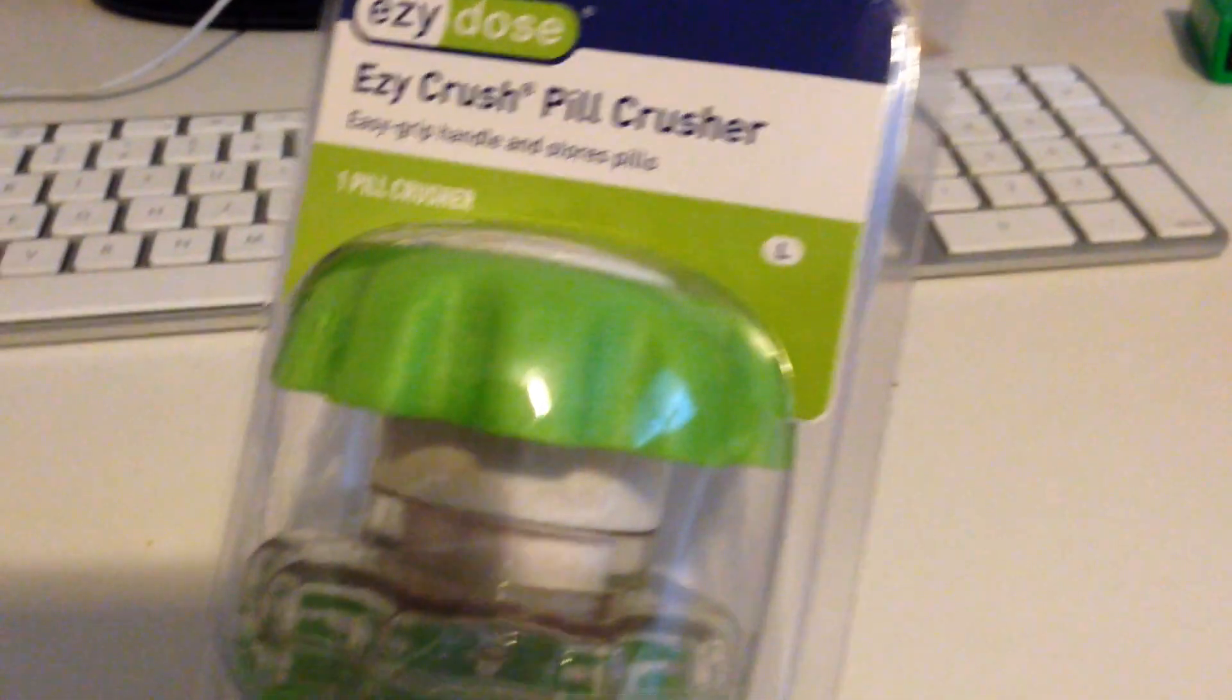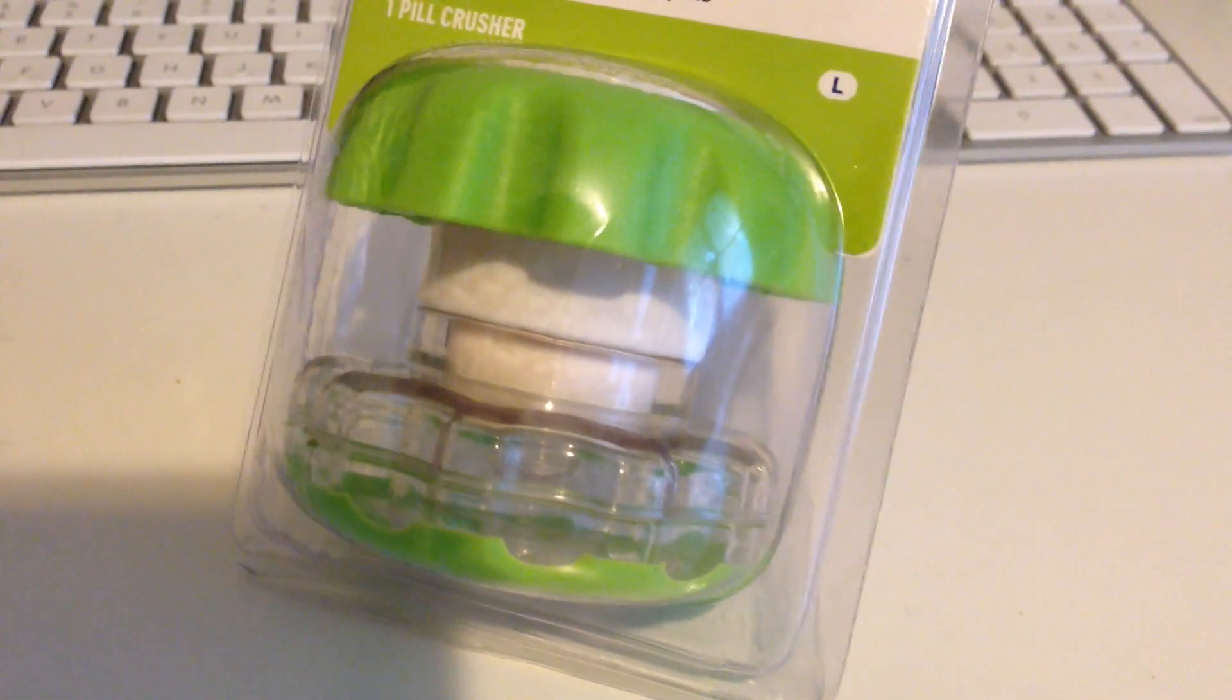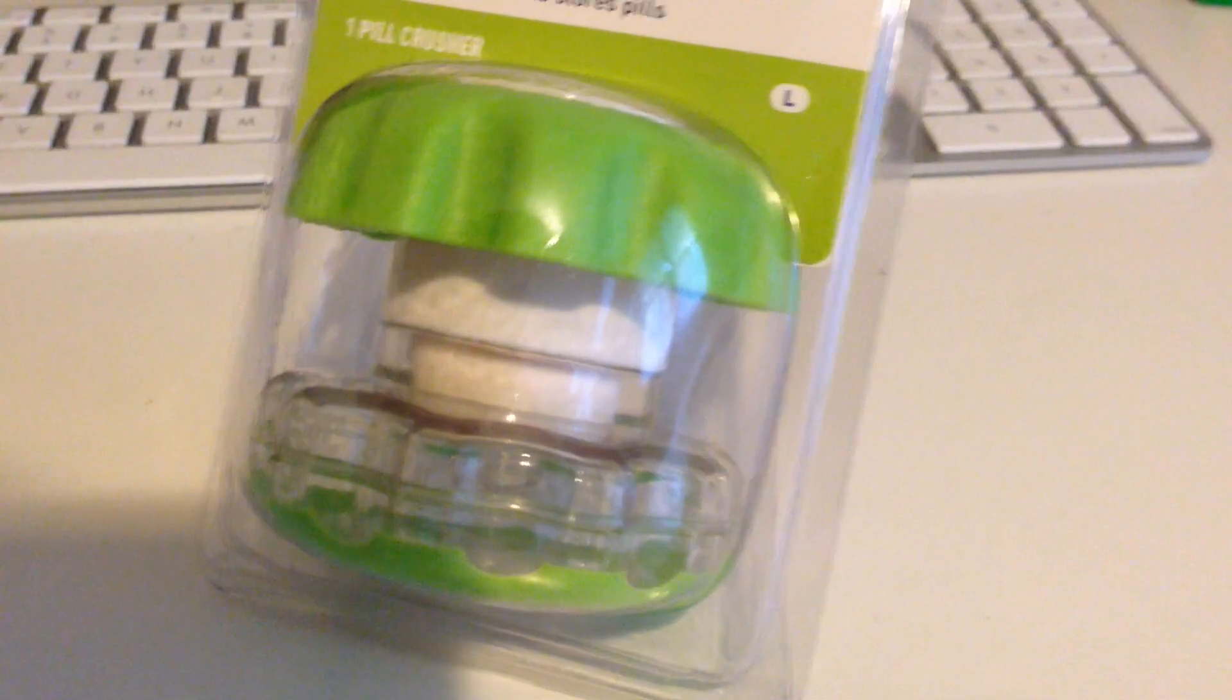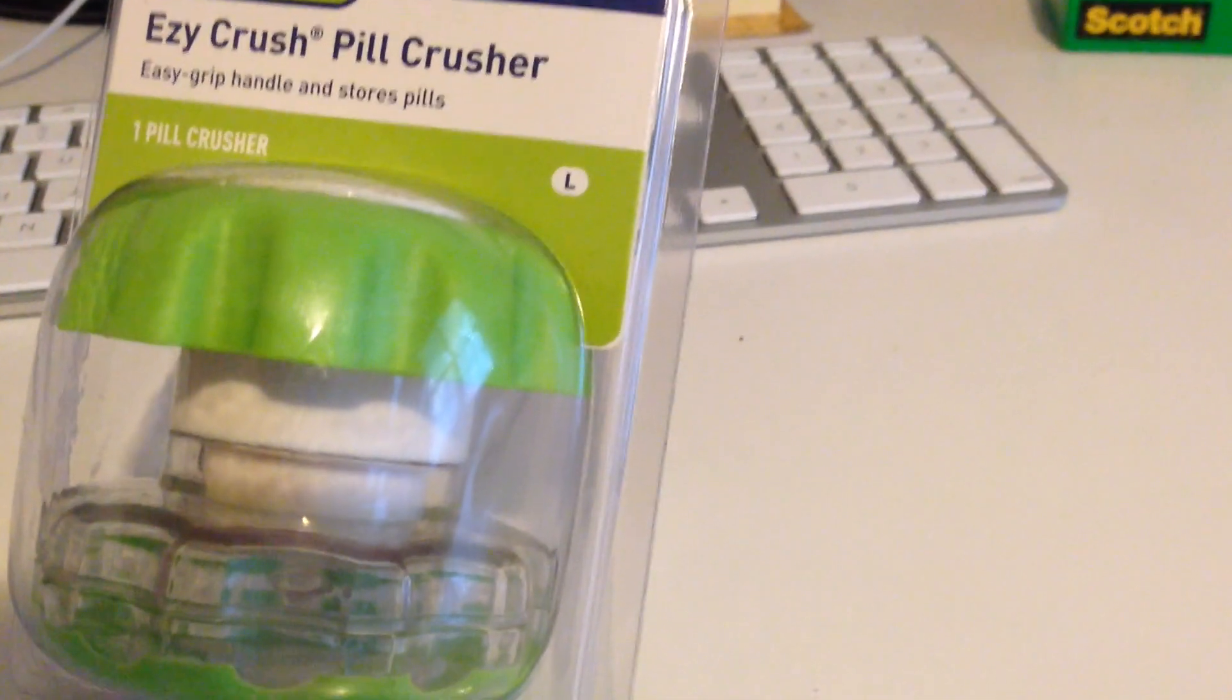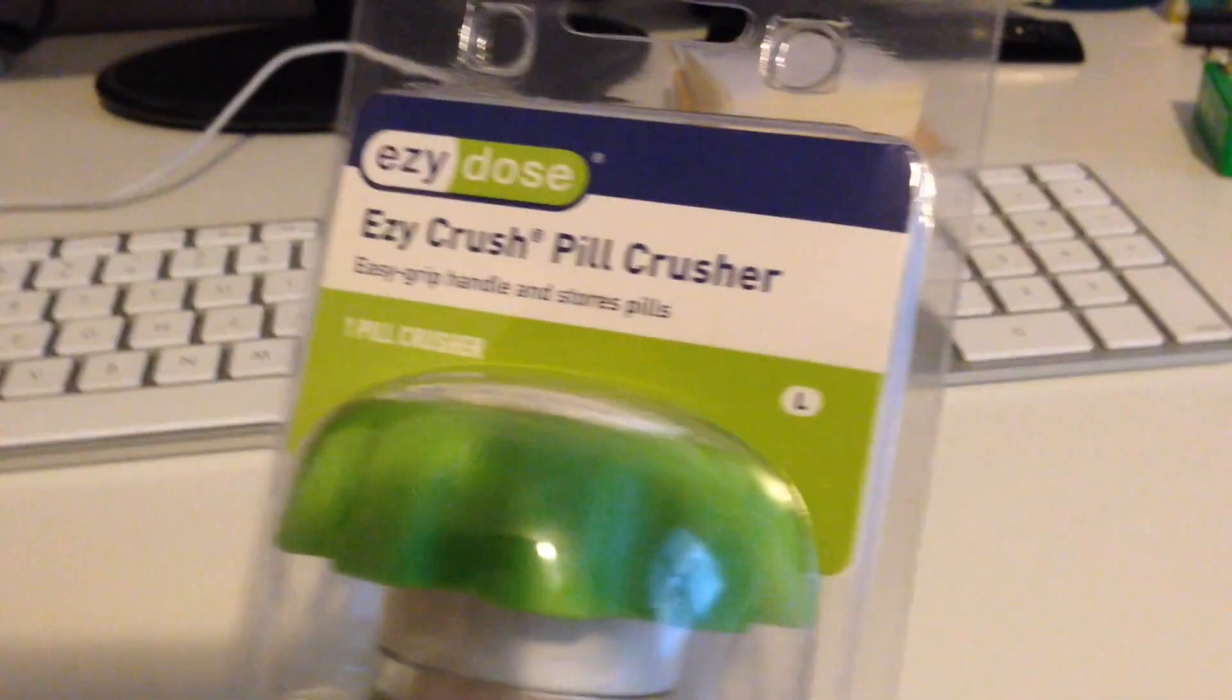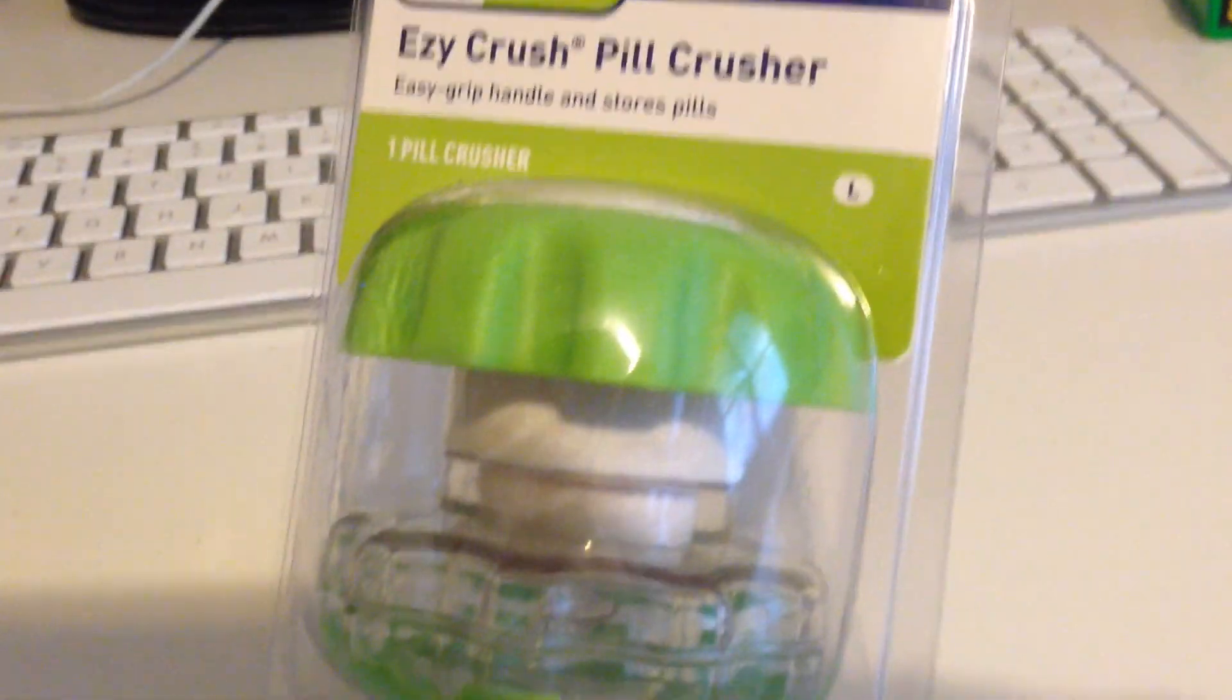I saw this on Amazon. This is actually a lot bigger than I expected it to be. They had a large and a small and I should have got the small but this will work too. I saw some reviews and videos about it, so I thought I'd check it out for myself.